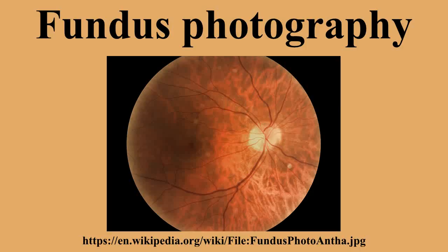Fundus photography in animals. Fundus photography is a useful tool utilized for veterinary research, veterinary ophthalmology, as well as education. Numerous studies have used it as a research method for the study of ocular and systemic conditions in animals.